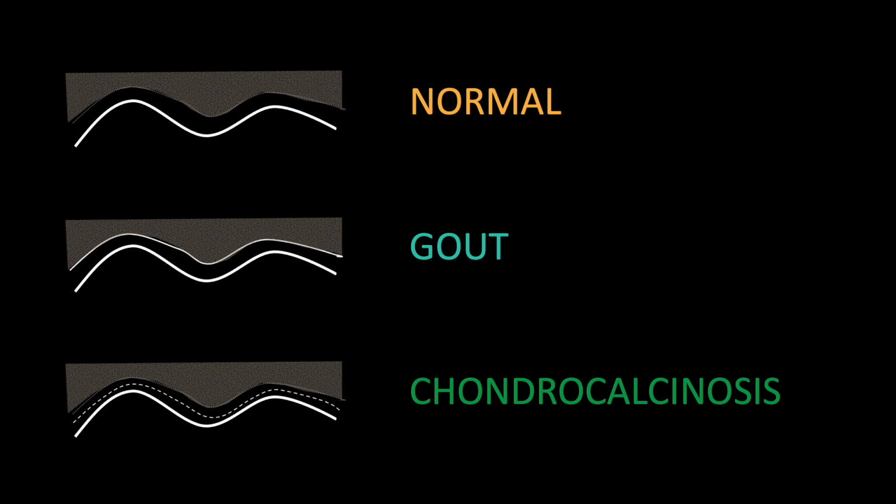So in the normal knee, in this suprapatellar max flex view, you should see the soft tissues of the muscle and tendons anteriorly in the near field. And then deeper to that, you'll see that wave of the femoral condyles, as I mentioned. And then the articular cartilage will have an anechoic appearance here as demonstrated.